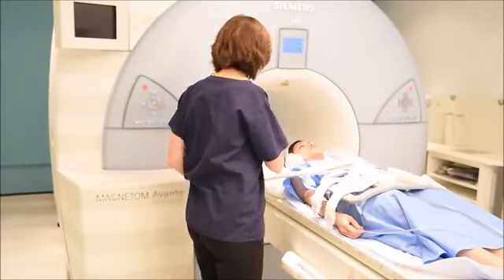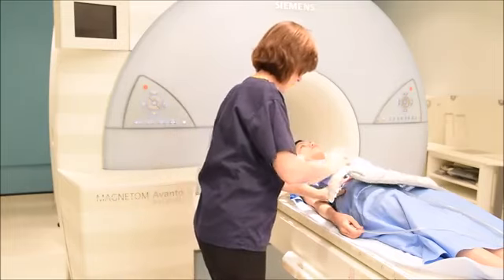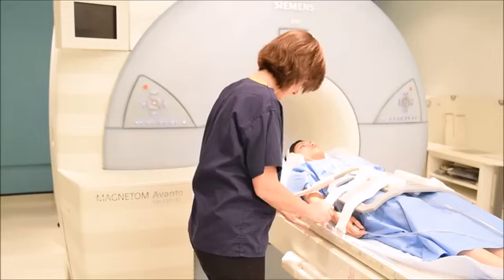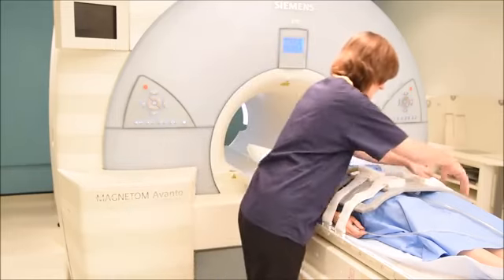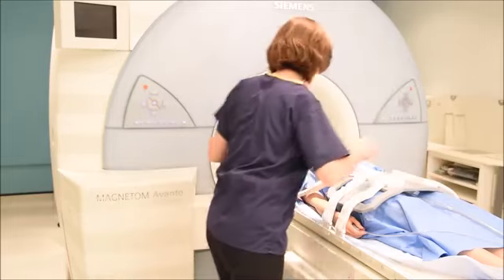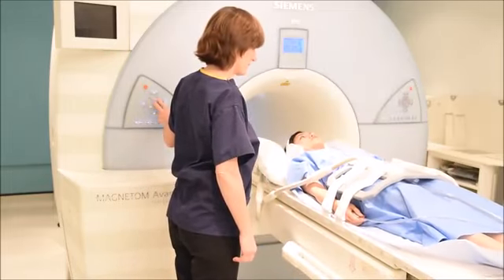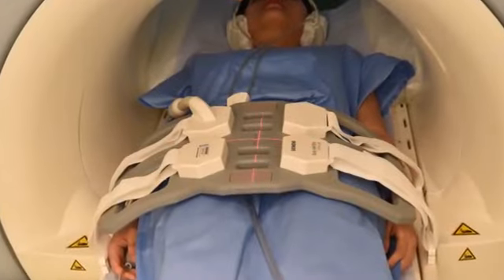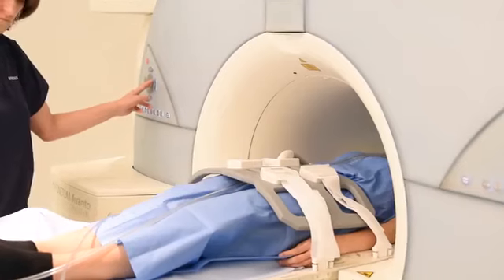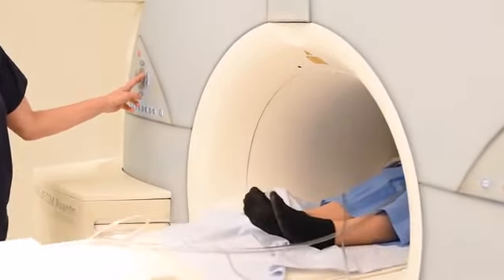Place a body coil across the patient's pelvic area from the iliac crests downwards. Secure the coil. Move the patient into the scanner and center the laser beam localizer to the middle of the coil. Move the patient fully into the scanner, making sure they're calm and comfortable before leaving the room.